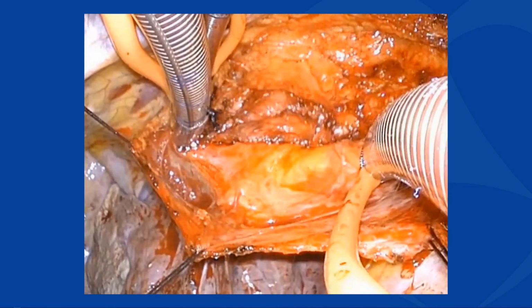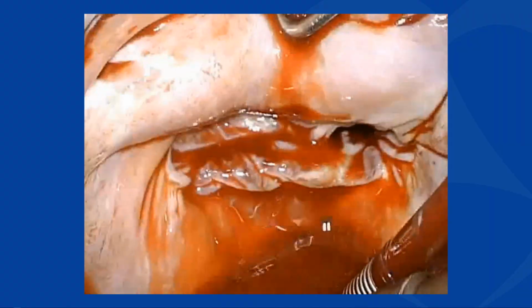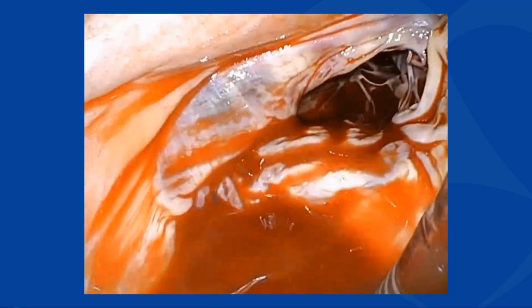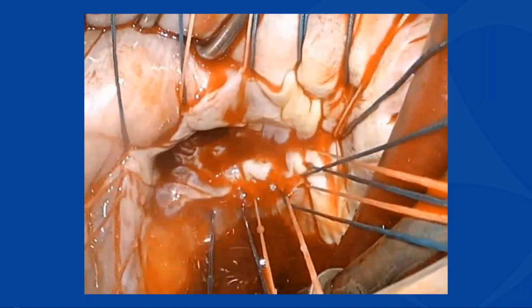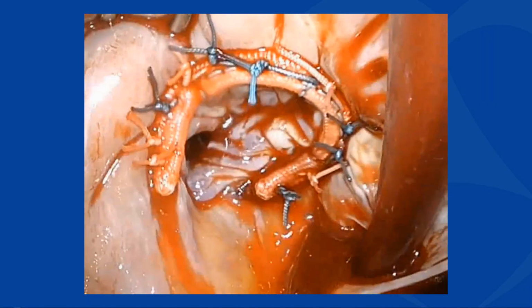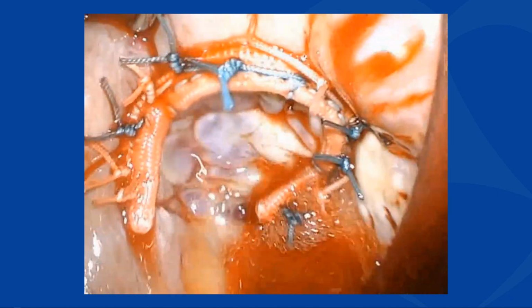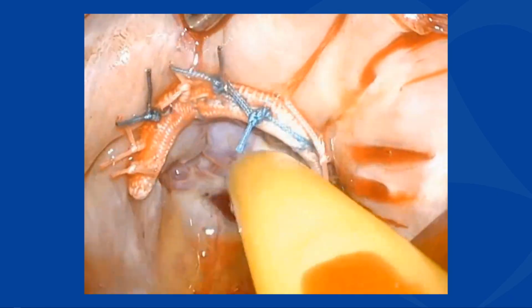Finally, I'm just going to end with this case. On some occasions we do a beating heart, isolated tricuspid with a bad right ventricle. I think you can safely do beating heart surgery. As Gaurav said, you can monitor the conduction system, the ischemia, everything. Every time I do beating heart, I have to vent the left side. I ask the anesthesiologist, but even if the patient doesn't have an ASD or shunt, it doesn't matter. The patient can still shunt air right to left through the pulmonary circulation, so I vent the root in all these cases. This is the final look of that valve. Again, we use the same ring, Triad, and then you get immediate feedback about the competence of the valve on the beating heart.